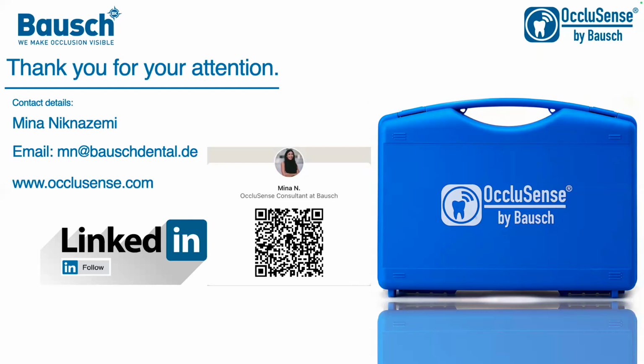You also said that the midlines have to coincide so that the area of incisors, premolars and molars is automatically calibrated in the software. It looks up the widths, so there isn't any specific adjustment like in T-scan, where you have to give the mesiodistal dimensions of the teeth.